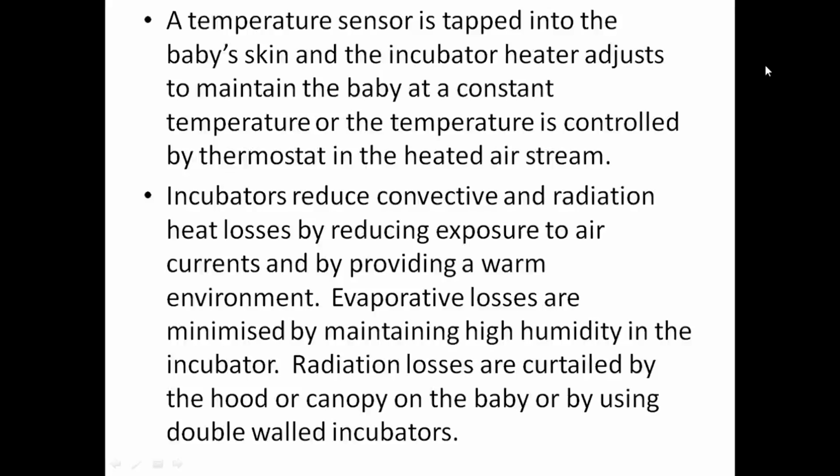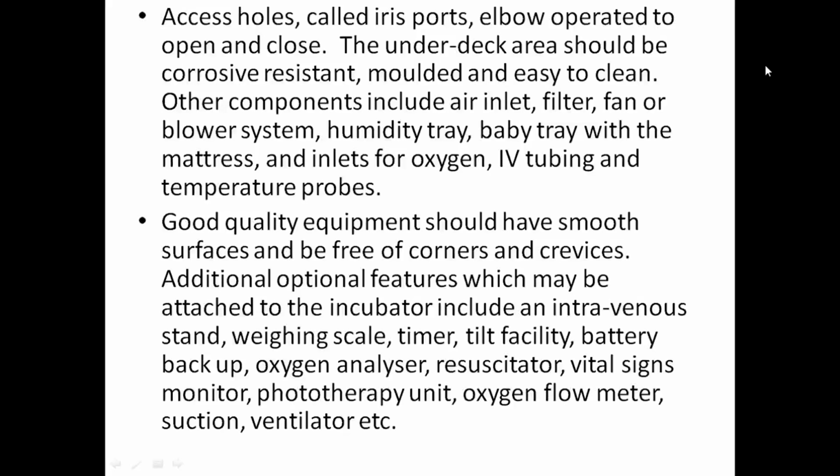Incubators reduce convective and radiation heat losses by reducing exposure to air currents and by providing a warm environment. Evaporative losses are minimized by maintaining high humidity in the incubator. Radiant losses are curtailed by the hood or canopy on the baby or by using double-walled incubators. Access holes called iris ports are elbow operated to open and close. The underdeck area should be corrosion resistant, molded and easy to clean.